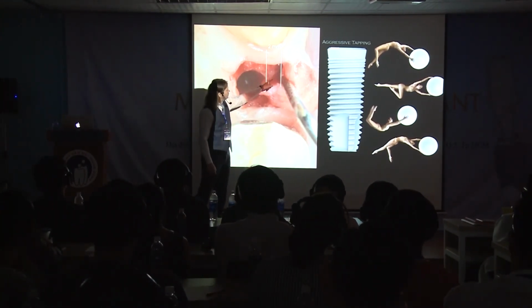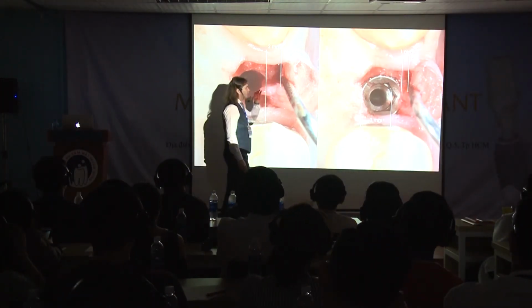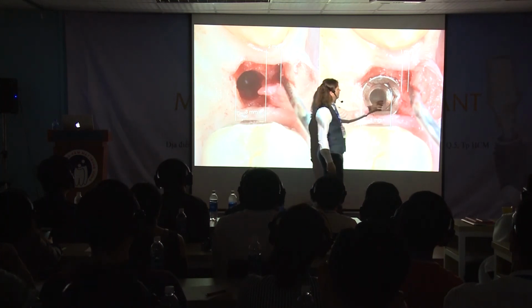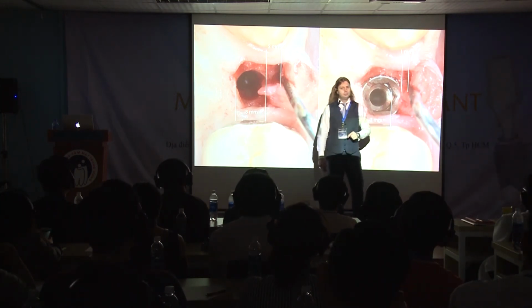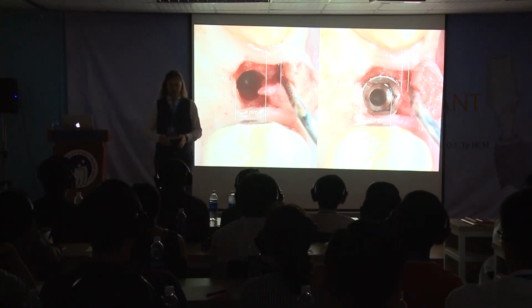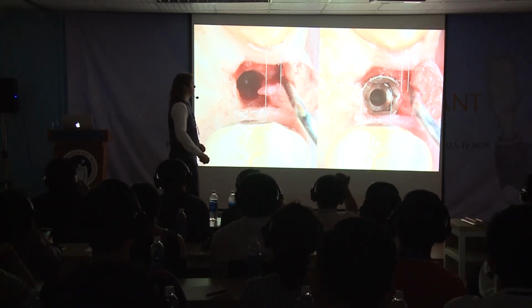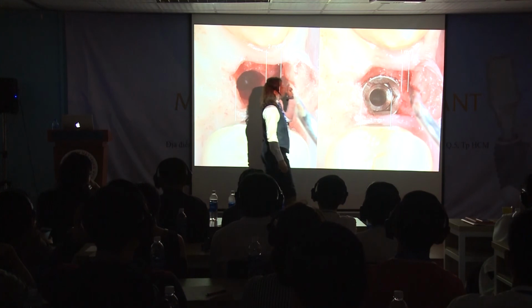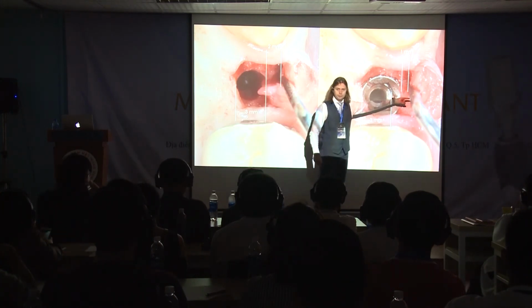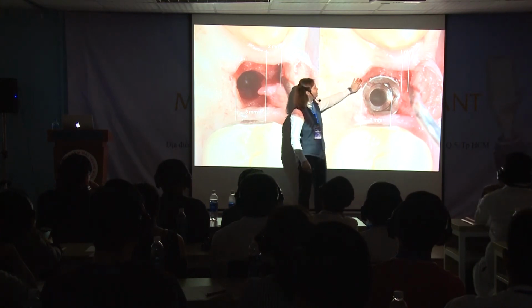So, if you have 2 millimeter, you place the implant, and then you have what? You always lose 1 millimeter by protocol. It's normal. And you will always lose in the buccal part, never in the palatal or lingual, because this bone is harder.